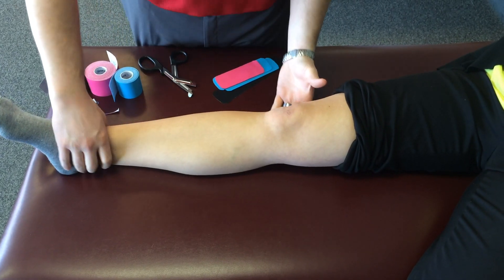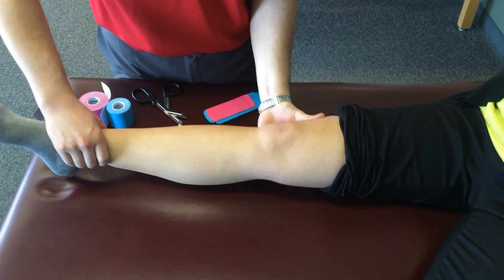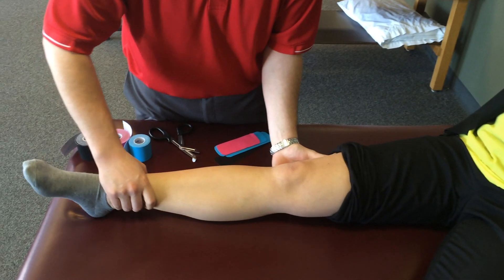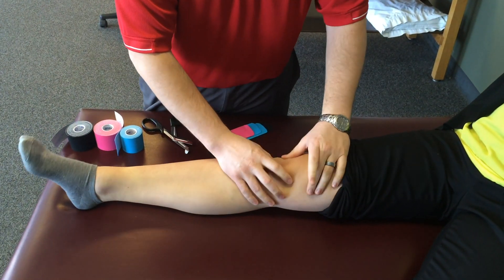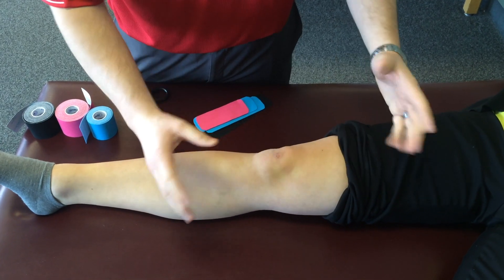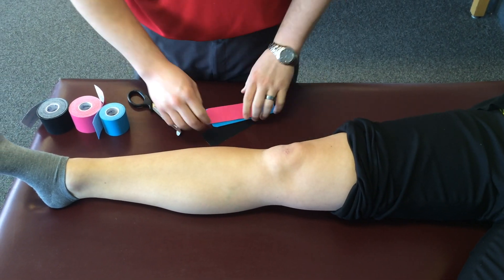So before I apply the strips, I want to make sure that Trisha's got good range of motion with her knee. We're just going to bend her up all the way and then straighten her back out. I'll just check the kneecap to see if it moves well here, if she has any pain with any specific motion. And then we'll get into the Kinesio Tape application.